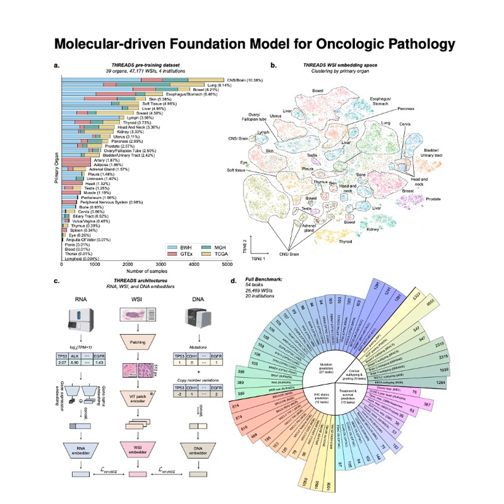It's the ultimate test, really. It means they took the complex universal image representation that Threads had already learned during its massive pre-training. The embedding. Right, the embedding. And they just put the simplest possible classifier on top of it, basically a single linear layer. No complex, deep fine-tuning for each task. So the heavy lifting was already done. The visual features Threads learned were already so well structured and biologically relevant that you barely needed to teach it anything new for the specific task.